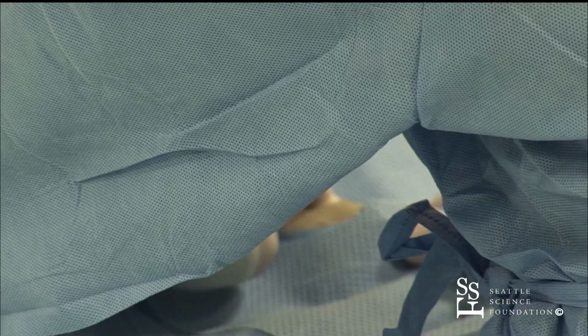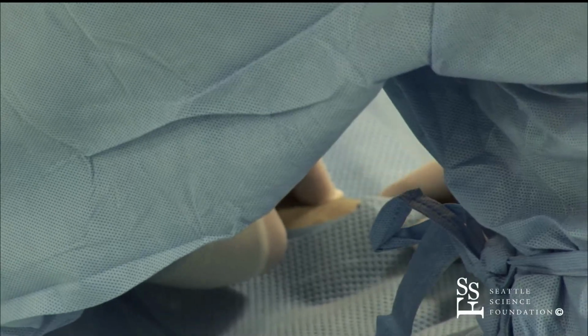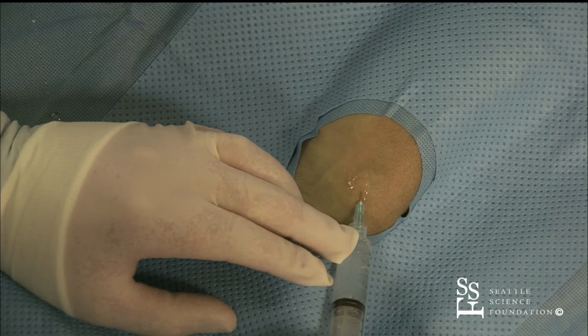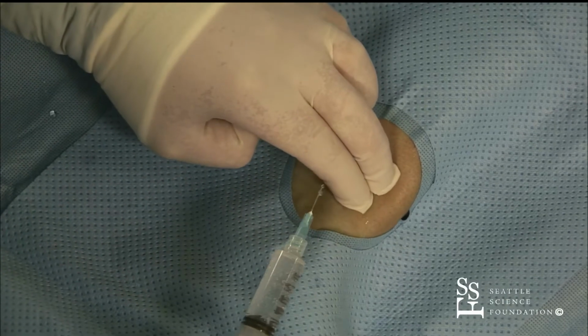So I'm really just feeling the pulse here, and it's got a nice good pulse. And you doing okay there? Okay, good. So John, you should say the pulse is barely discernible. Right, right. Theatrics, right? A little more numbing medicine here. You just raise a little wheal there.